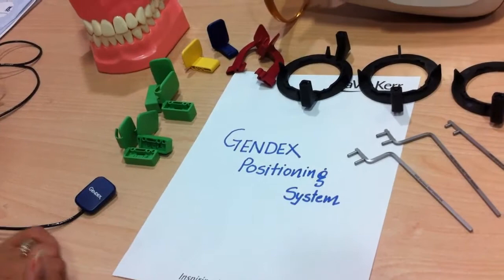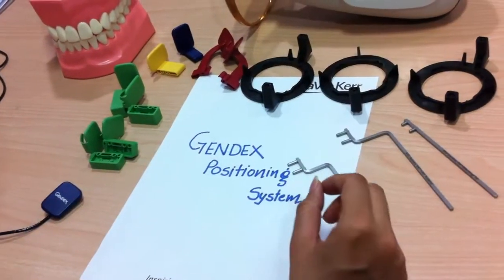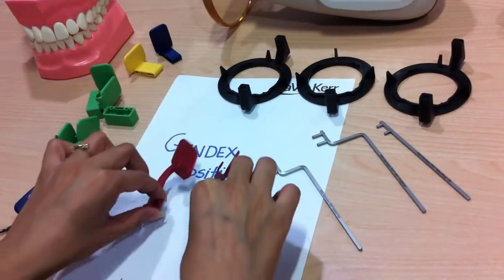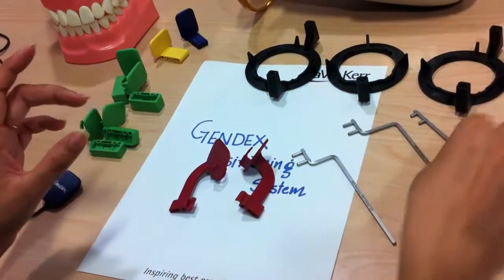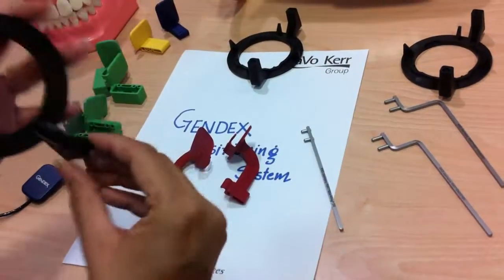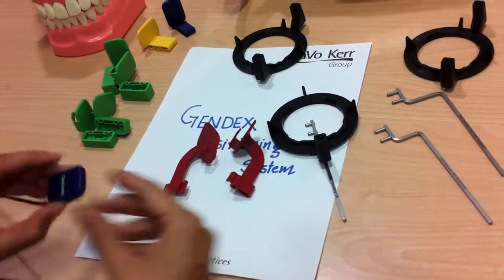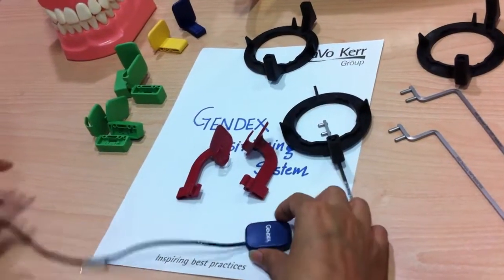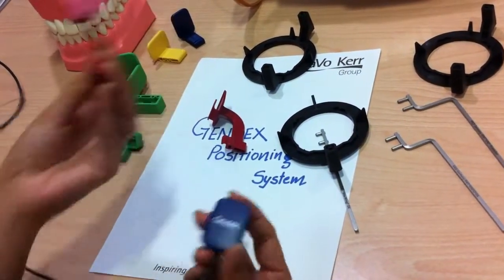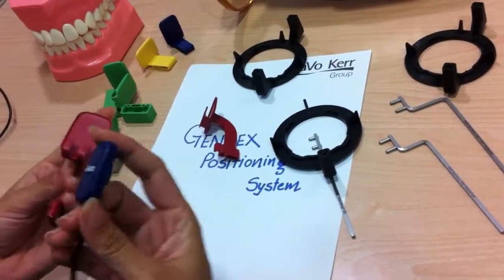Let us start with assembling our accessories for taking the scan. We will start with the bite-wing holders. For bite-wing we will need our red holders, the straight bar which is for bite-wing, and the bite-wing aiming ring which has only one holder for the bar — and of course our sensor. We will start with the vertical bite-wing holder.